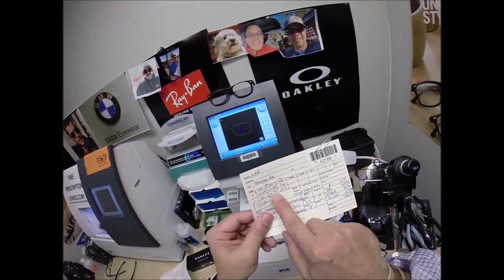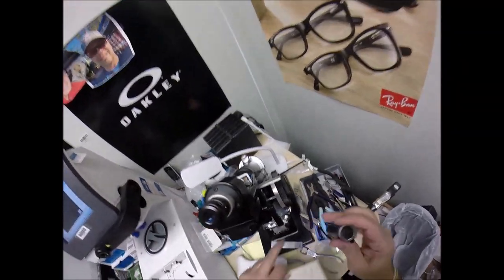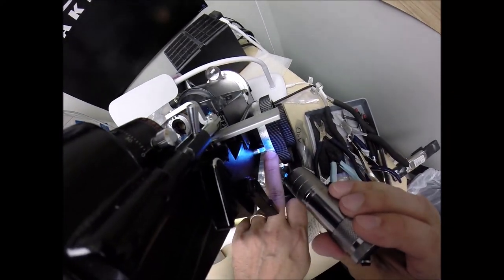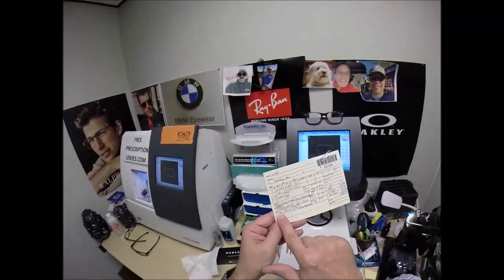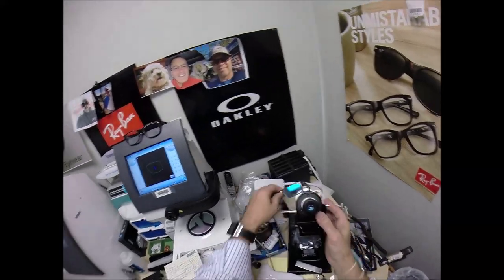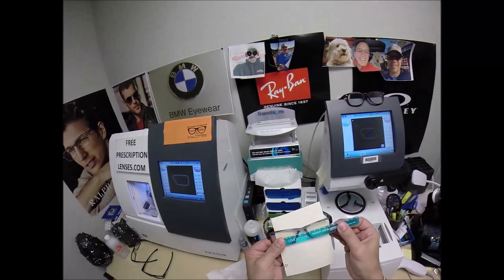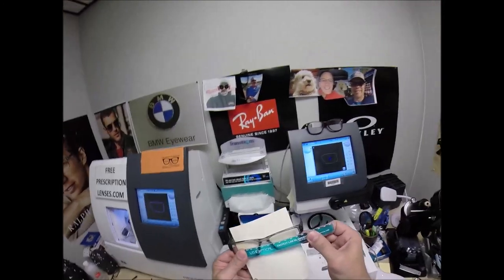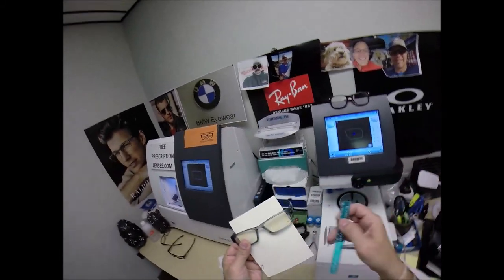You have three steps of astigmatism correction. Let's check that. And we end up at minus 75, one tick mark away from one. So that is cut perfectly. Your pupillary distance for the right eye is 34, the left 35.5, for a total of 69.5. I'm going to turn the card around. Place my PD stick against my thumb on your right lens. And then when we hold it up to the left lens, we're getting 69.5. Man, the kit is good.